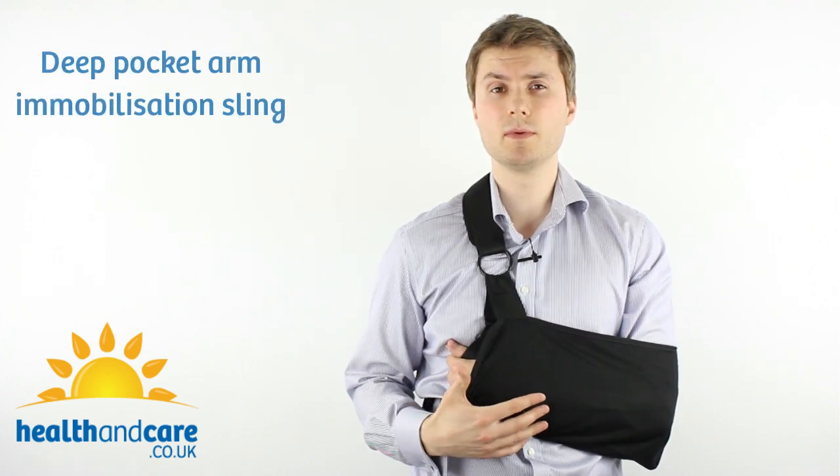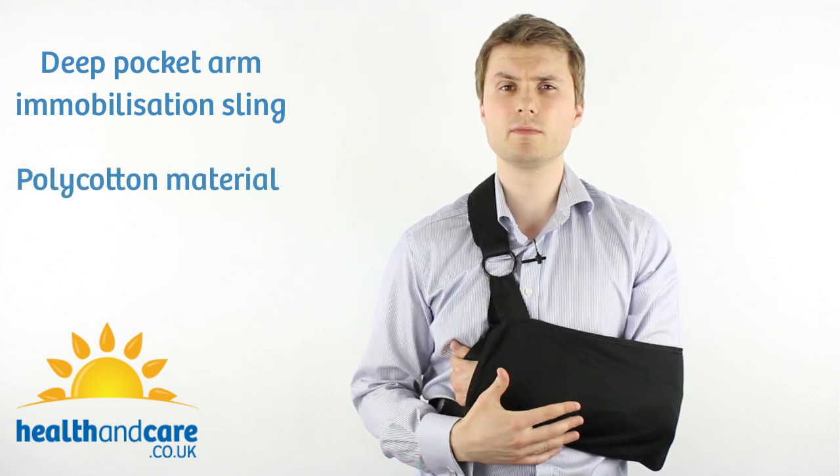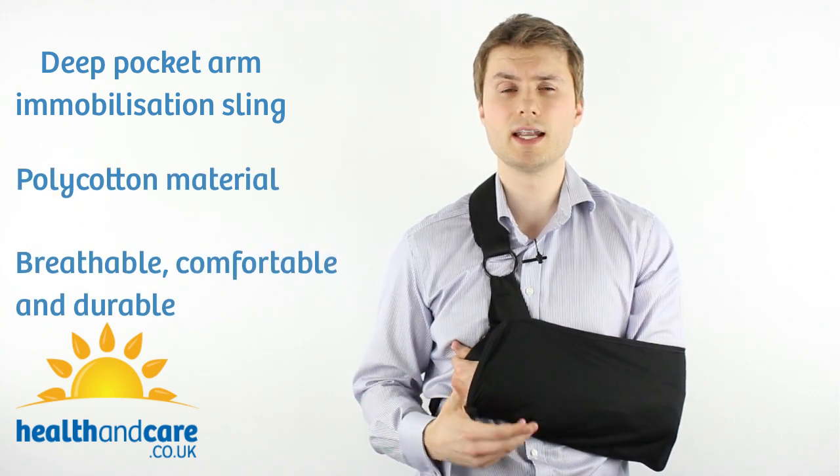As you can see from the design, it's a deep pocket arm immobilisation sling. My arm is resting in there and it's very comfortable. The poly-cotton material means that it's breathable, comfortable and very durable.